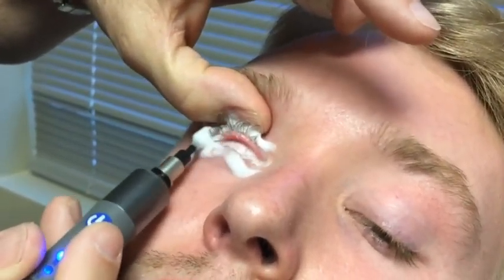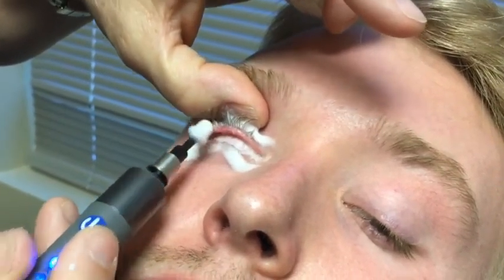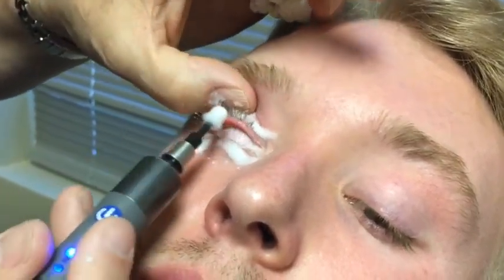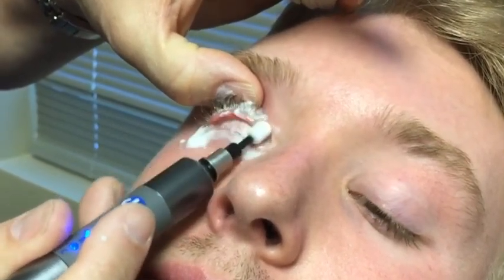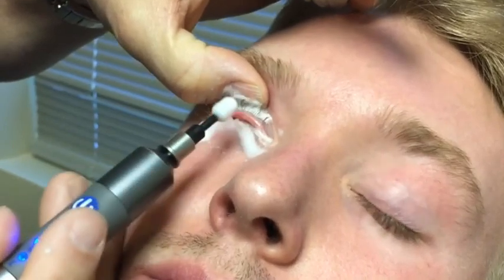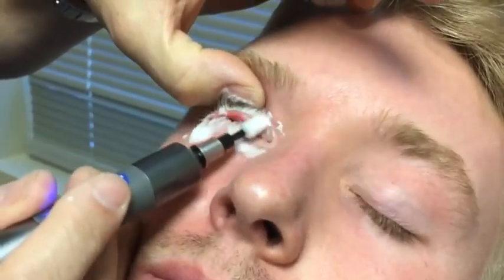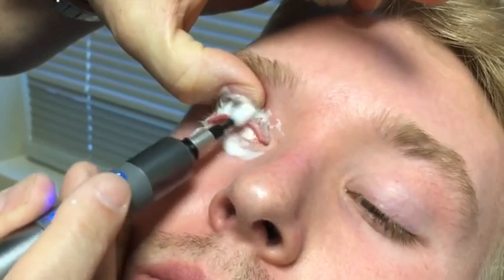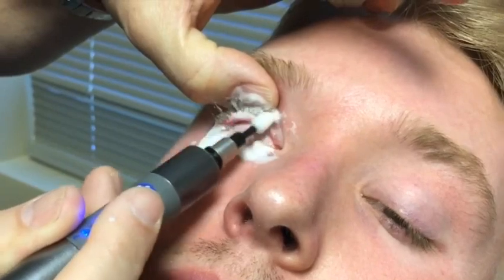You hear the motor slowing down, that's what you want. You want to push just hard enough so it starts to slow the motor down. Try to keep the face of the sponge flat. If you have to, go and reposition. Now I'm going to ask the patient to be very uncooperative. Squeeze your eyes really tight like you're an uncooperative patient. See, even in patients who squeeze and have that big strong squeeze reflex, I still own that lid margin. It doesn't matter what they do, I can still treat it.